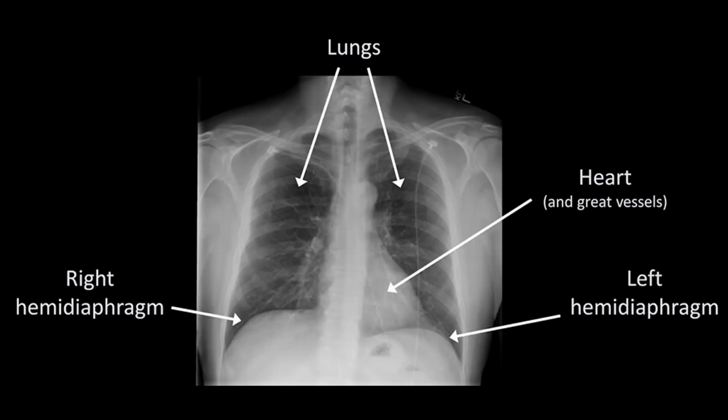Now, for completion's sake, in most abdominal X-rays, we look for air under the diaphragm. In case of any perforation of a hollow viscus in the abdomen, air will be released into the peritoneal cavity, and due to the property of air, it will collect just beneath the right and left domes of the diaphragm. Sometimes these domes of the diaphragm are not that visible in the plain X-ray of the abdomen, anterior posterior view. So sometimes, for confirmation, we take the chest X-ray also to identify the domes of the diaphragm and the surrounding structures there.